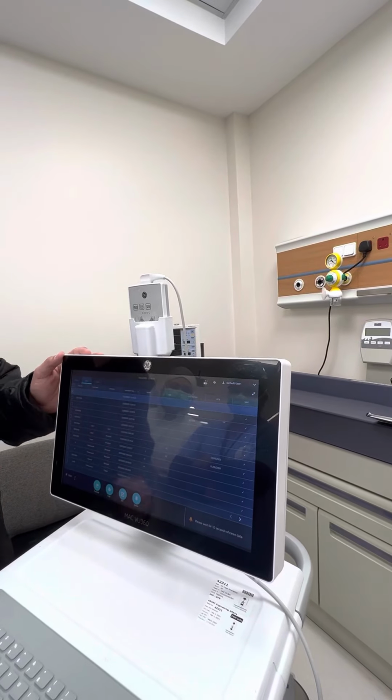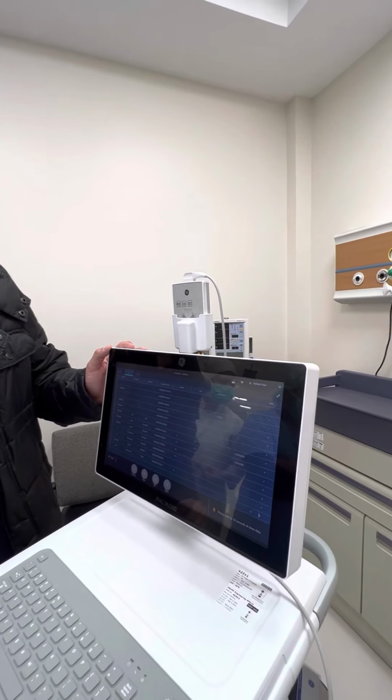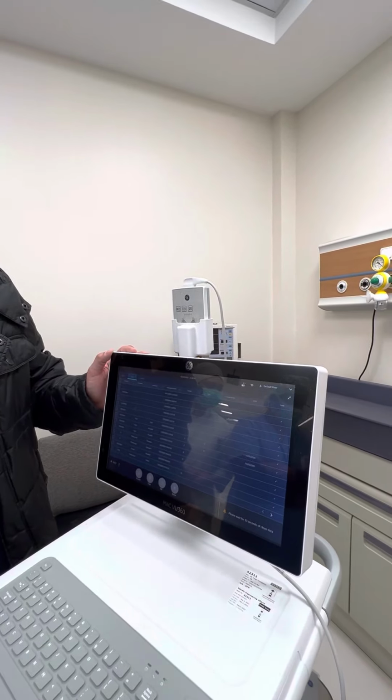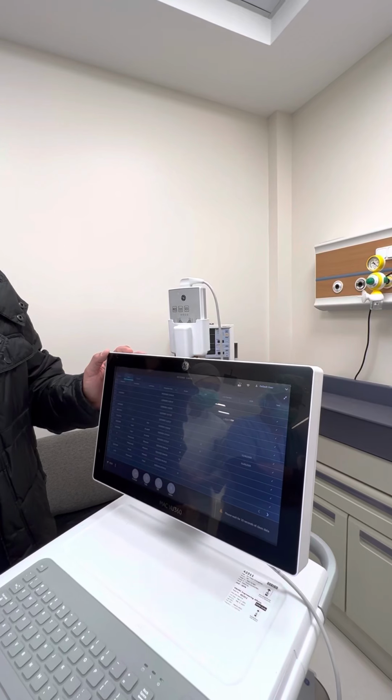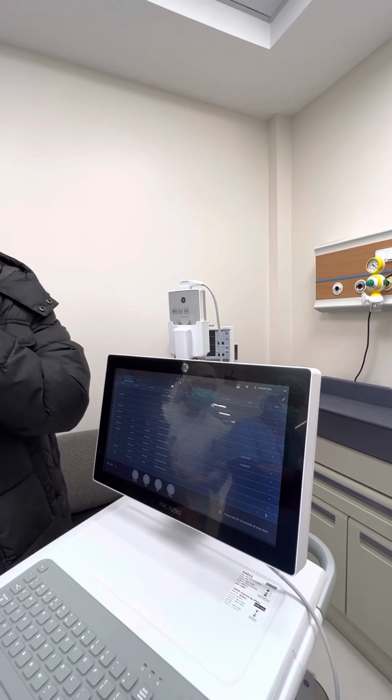I have one thing to clarify. Suppose we receive a patient in the ER, we don't have any file. Immediately we do the ECG. Then after some time the doctor decides this patient needs active treatment, and only then will he get a file number.